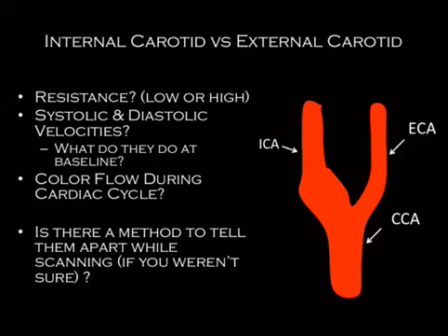So are there ways you can tell the internal carotid versus the external carotid apart? Yes. They operate very differently. The way to think about it is that your brain is always on, requires continuous blood flow, regardless of what you're doing. If you're sitting down or you're sleeping or whatever, your brain is never off. So it requires continuous diastolic flow, and the diastolic flow should never go to baseline. And because it's always on, it should be easy to get blood flow to it, so it's going to have a low resistance waveform.